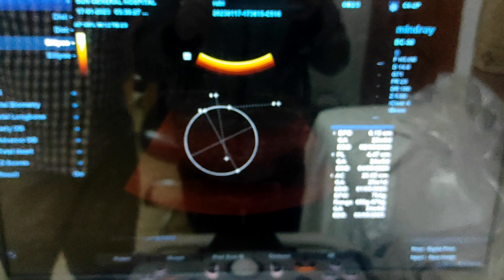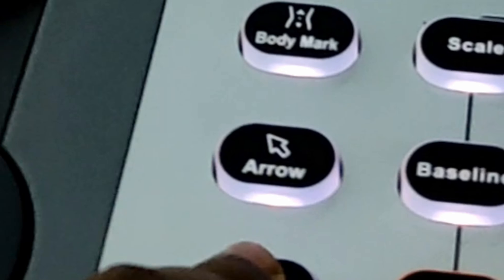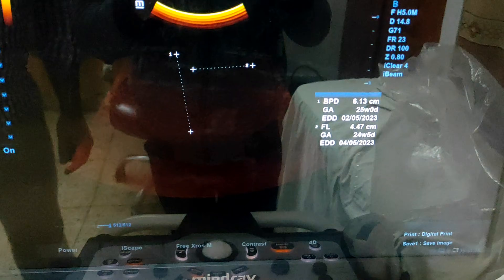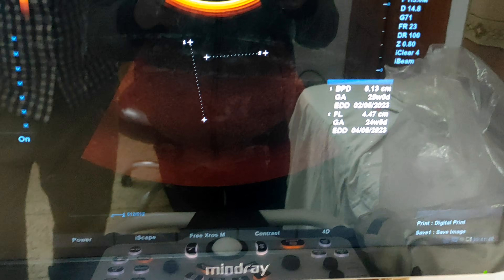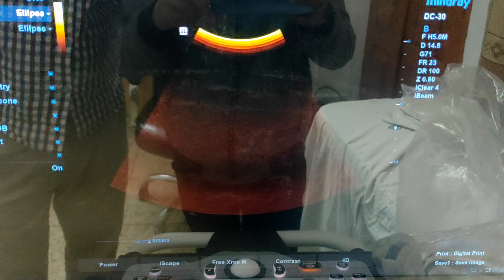To remove the screen information, you have to press the clear button. This one is the clear button. Just press one time and one information is cleared. Press the clear button another two times and the other two items of information will be cleared.